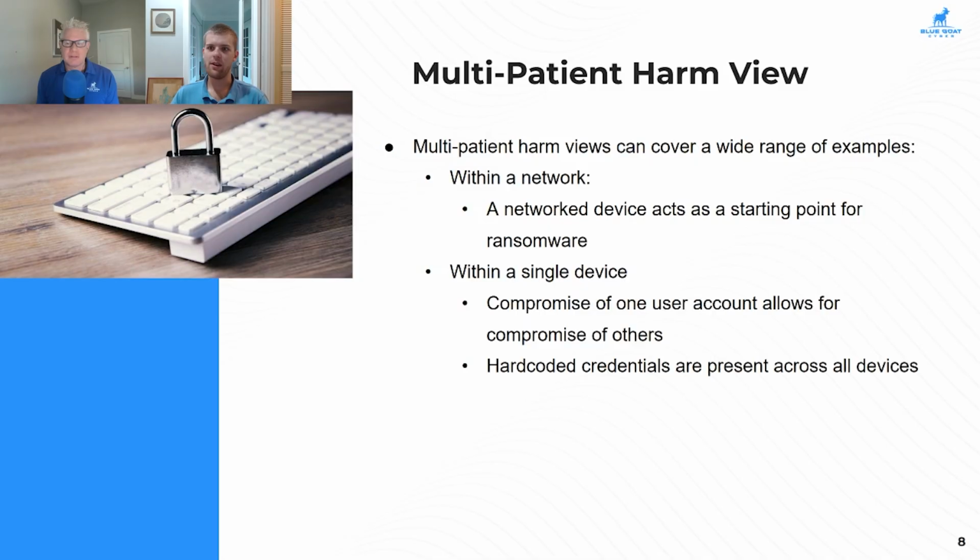We've even seen some solutions and workarounds to this, like having individual tenants for different clients. So let's say that a service provider has a cloud-based solution that they want to sell into different healthcare delivery organizations. They make their own tenant for each HDO, and that prevents the risk of multi-patient harm scenarios by tying it more to an individual organization and having less risk of storing all sorts of data in one place. So there are a lot of different solutions to this. Some alternatives are just ensuring that your access control is extremely well configured in your application, though it can be a little bit of a risky approach since it just takes one problem to essentially lead to this full compromise.